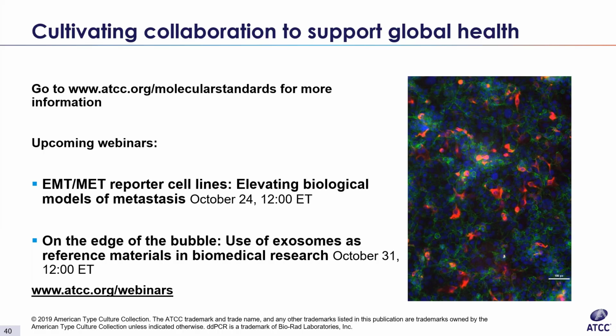So there were about 10 or 11 respiratory viruses that were not downgraded and are still at BSL-2. We did this at the time with the idea that these were going to be used primarily in clinical labs that were already operating at BSL-2 and that it wouldn't be a problem. But we got really strong, fast feedback that we do need the downgrade. So there's 11 of them. All 11 are going back through for safety testing and downgrade in the near future.